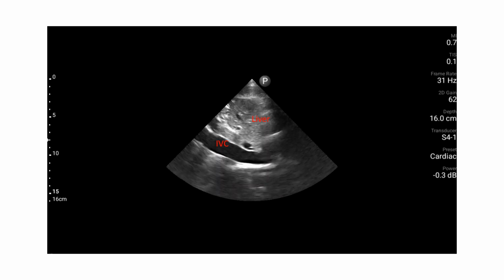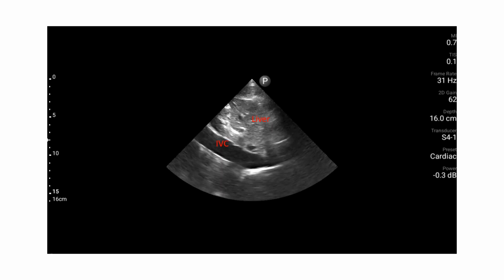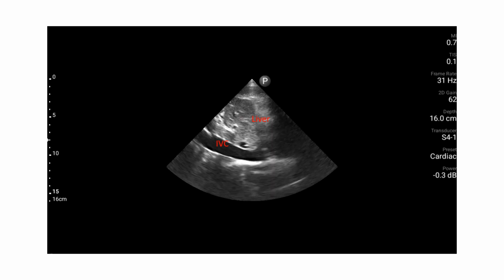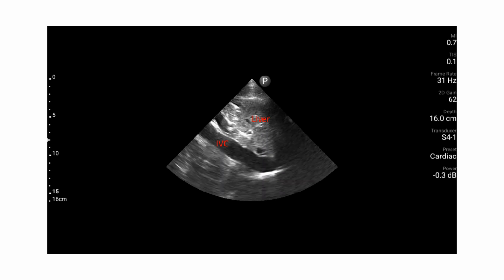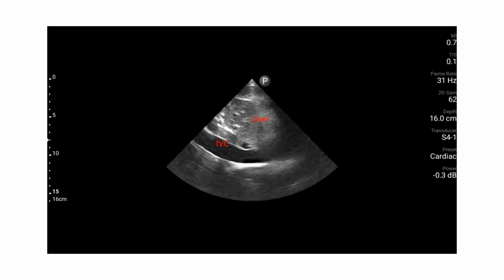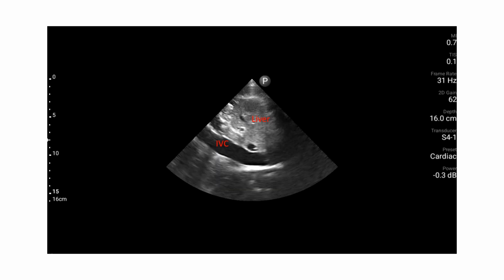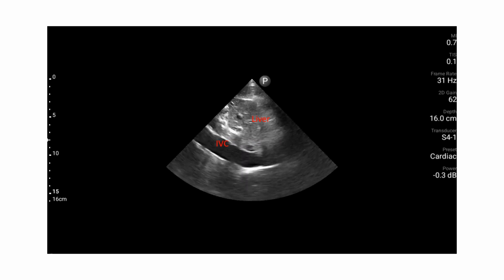So your liver is up top. You can see it's moving back and forth with the patient's spontaneous breathing, and you can see the IVC, which if you were to measure that out, normal IVC is somewhere around 2.5 centimeters in diameter if you're measuring from the outside of both walls. And the evidence will say that a collapsibility, so you can actually notice it's collapsing just a little bit with spontaneous breath. If you had the patient breathe in sharply, a normal finding, what we call a sniffing maneuver, you would expect to see the IVC collapse by about 50% or so.